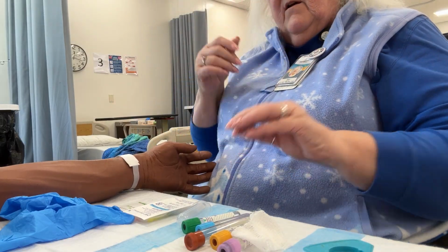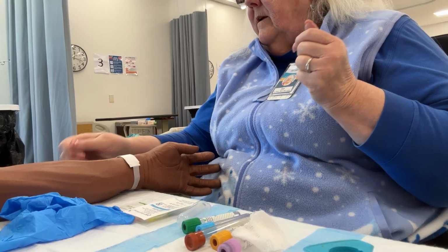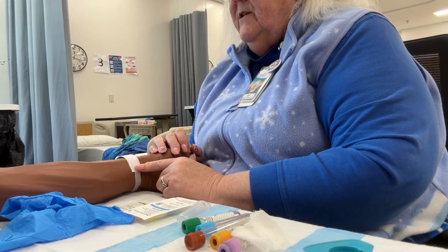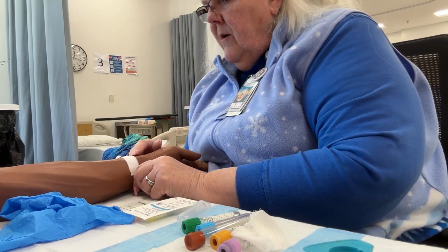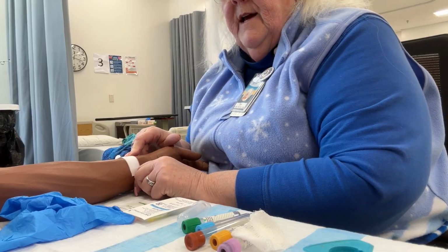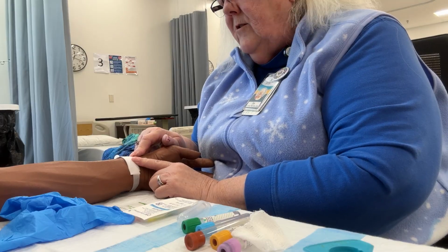All right, so washing my hands, go in. Hi, my name's Jan. I'm going to be your nurse today, and I'm going to draw your blood. Can you tell me your name? Chad Whitney. Can you tell me your date of birth? 6/16/2008. I'm checking that with my orders. And then, do you have any allergies?